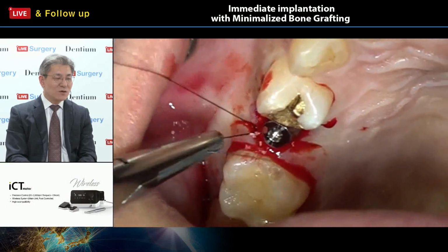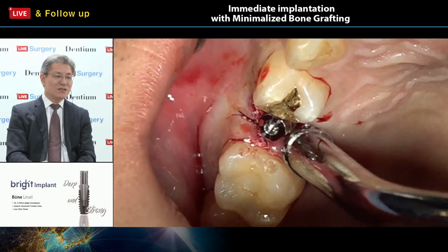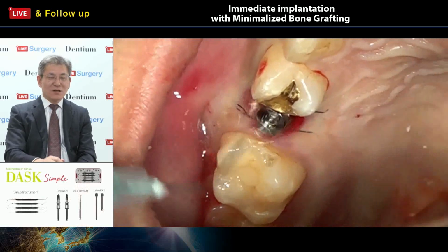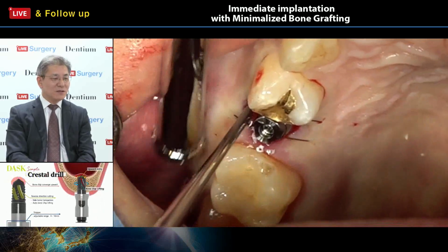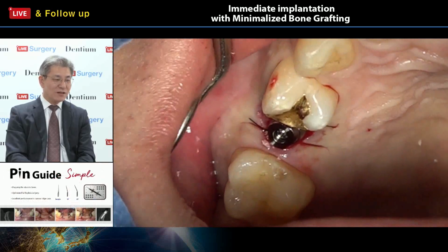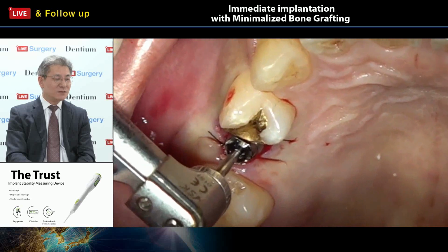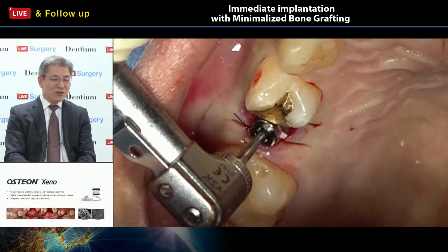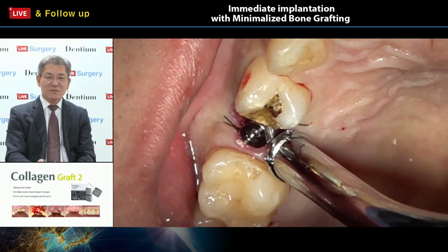Some guys prefer to make a cross suture, an internal cross suture, and some guys just use interrupted sutures, and you can try this horizontal mattress style suture also. Depending on the suture style, some benefits are a little bit different. However, for these small socket areas, interrupted or internal cross sutures and this horizontal mattress style don't matter.